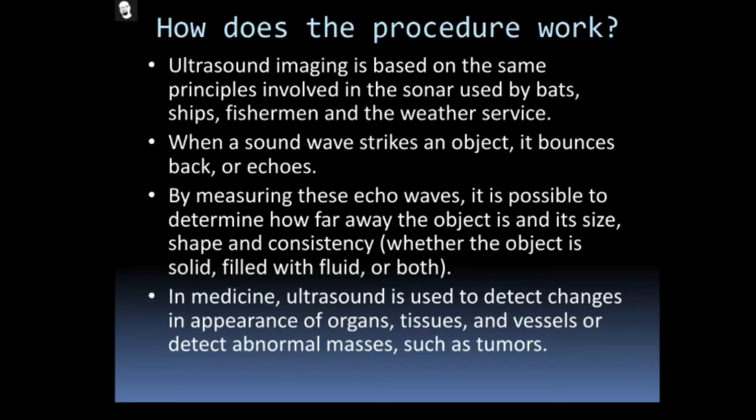By measuring these echo waves, it is possible to determine how far away the object is and its size, shape, and consistency, whether the object is solid or filled with fluid or both. In our human body, some organs are filled with fluid and some are not. Whatever the organ may be, once the sound waves strike it, they return back.